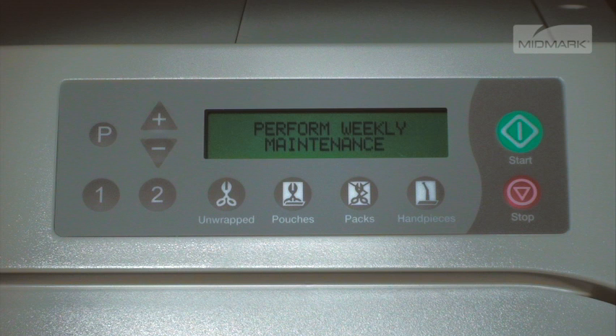To assure proper operation and maximum sterilization life, the M9 and M11 provide the operator with maintenance reminders on the display screen. The reminders are removed from the display once the cycle is started.